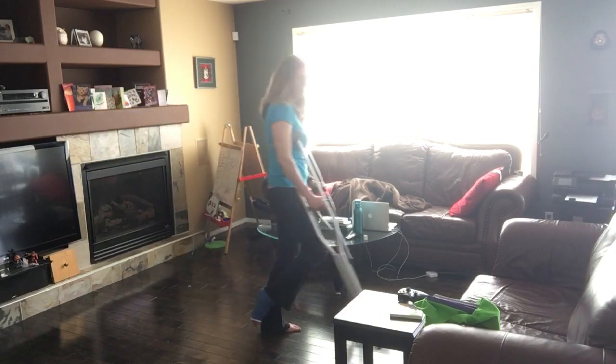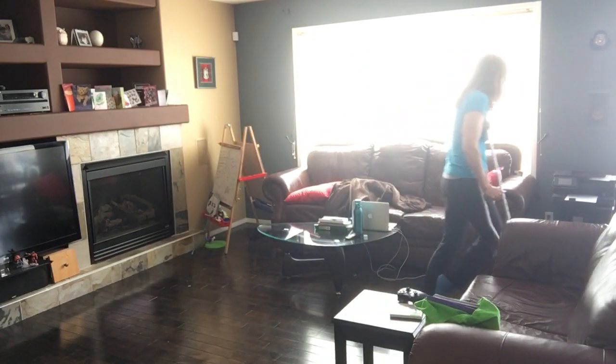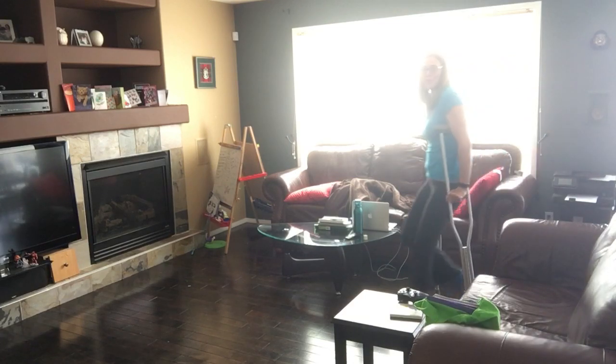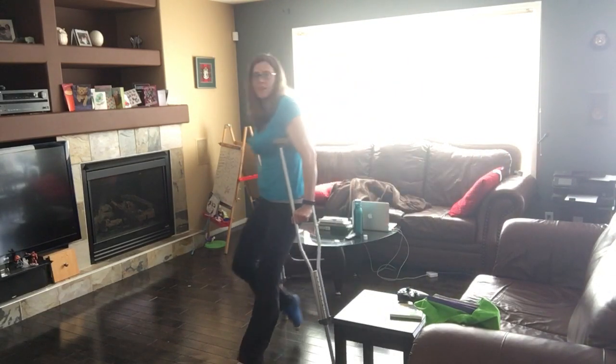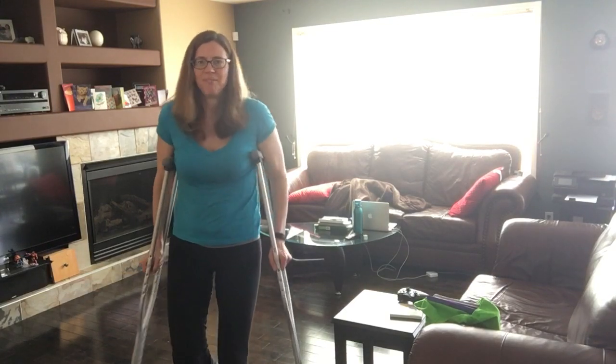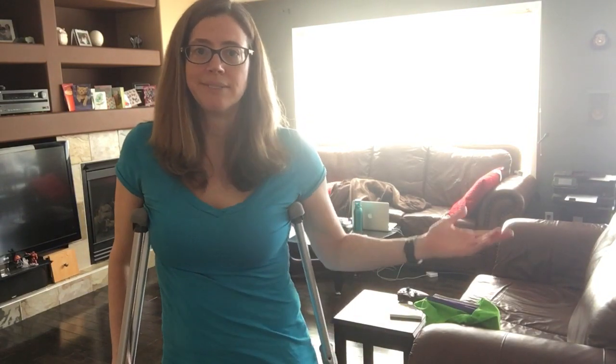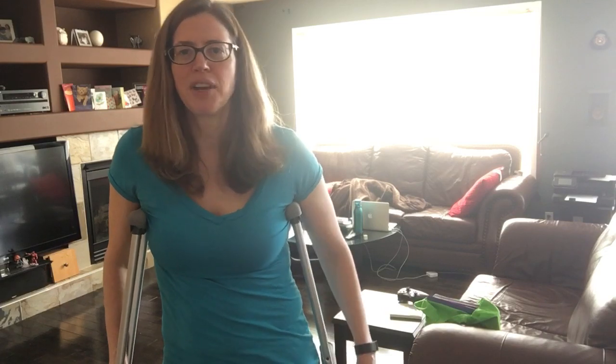You do want to be careful, of course, just like anything else. Practice is going to make it that much easier. I hope this is helpful, and if you have anything else you'd like to see or any questions about how I'm managing, or you just want somebody to commiserate with, I'm here.